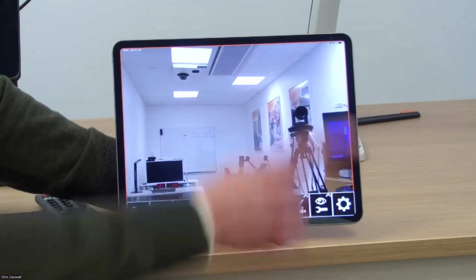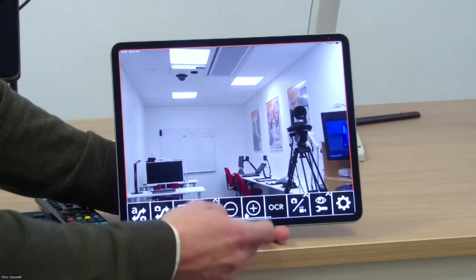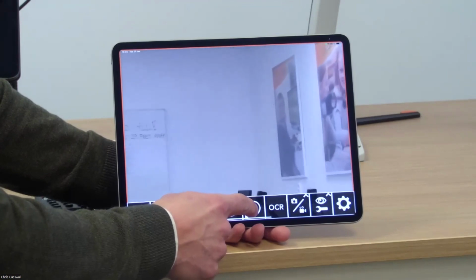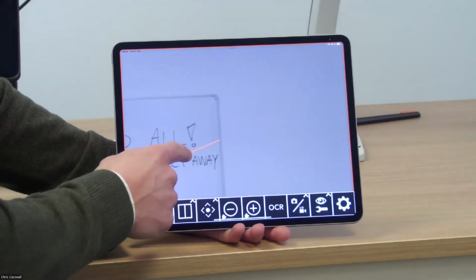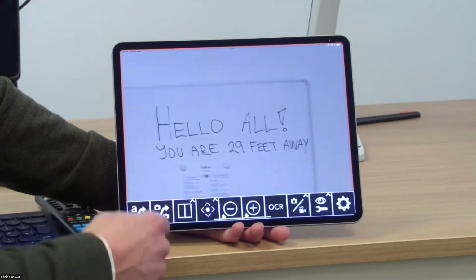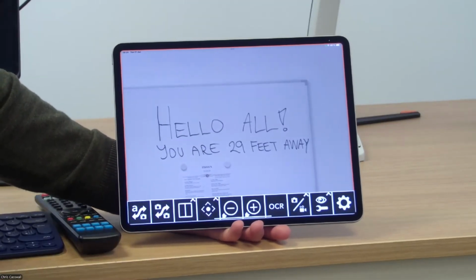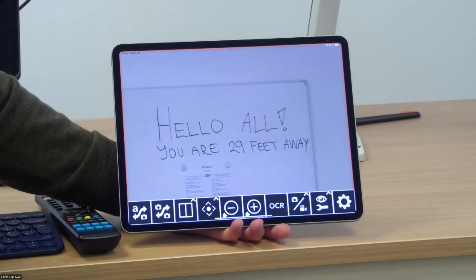We are currently looking straight across this room. This is our demo room in Sweden. And I will demonstrate going quite a long way here with the magnification. I did prepare this for a previous webinar I did with the US, but the camera, the MagniLink Air Go, is 29 feet away from this whiteboard.